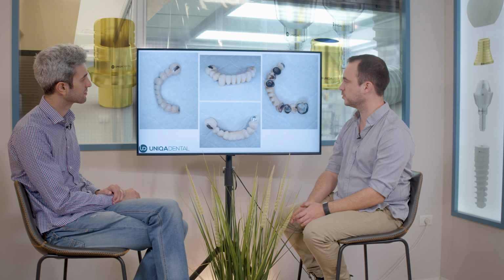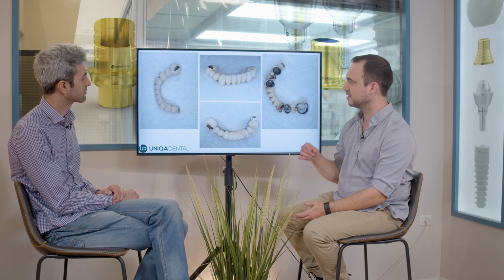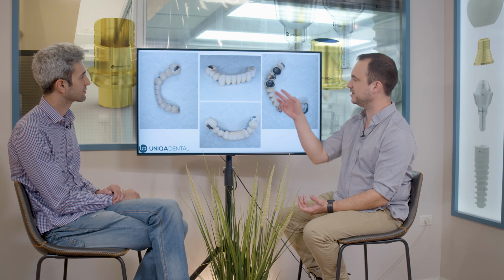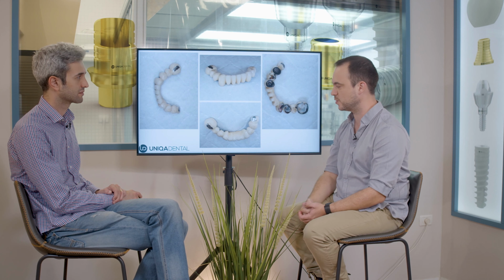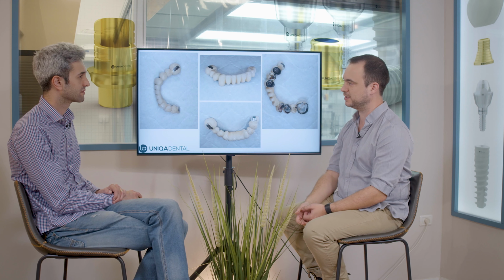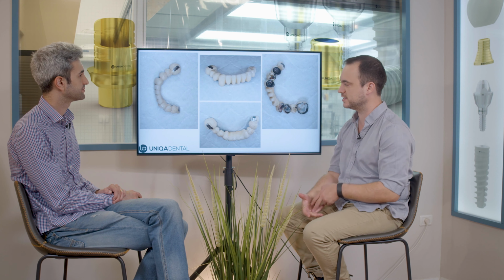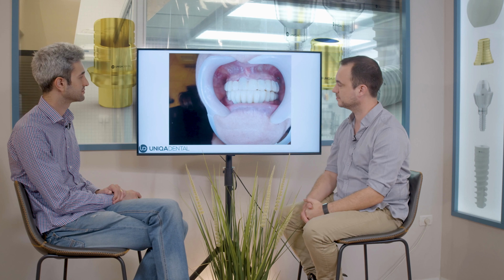This is the bridge that we took off. You can see that the teeth are just rotten. You can see parts of the teeth, the post cores, everything is glued to the teeth. There was nothing left from those teeth. So it's not for the aesthetical part that we took it off, it's from the biological part. This is the new bridge.